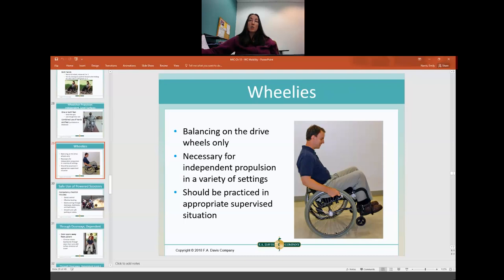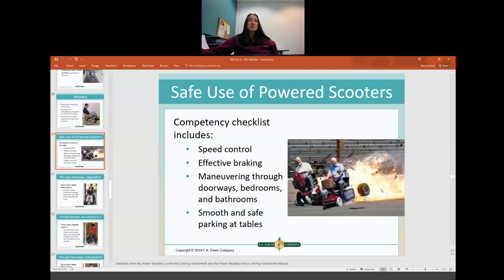Doing a wheelie — balancing on the back wheels — is pretty necessary for independent propulsion. There are certain situations where you have to get into a wheelie before getting on a curb or moving over an object in your pathway. You should practice this in a controlled environment so if they fall, they're not getting hurt. For power mobility, make sure the patient is competent in controlling speed, braking effectively, maneuvering through doorways, and safely slowing for parking at tables.